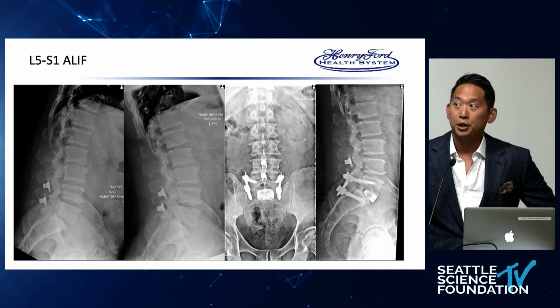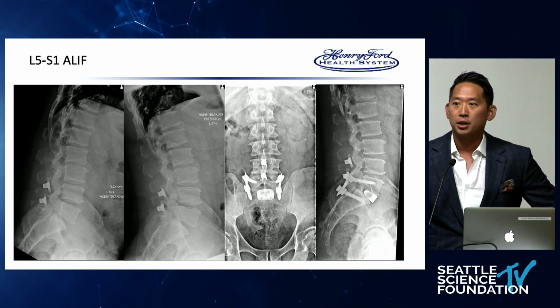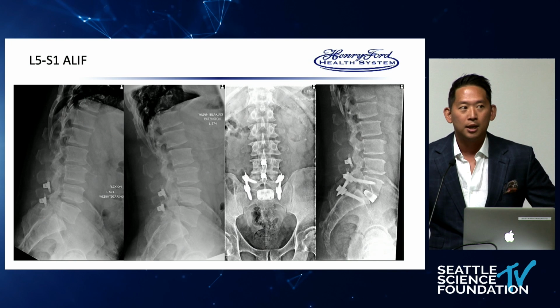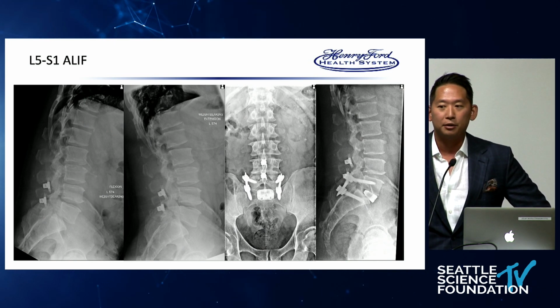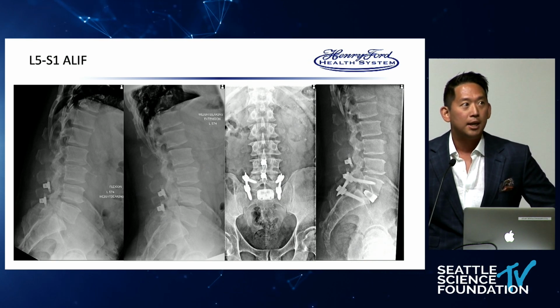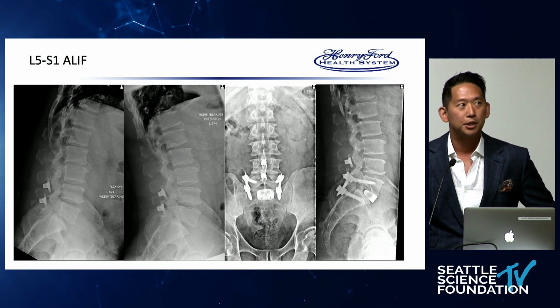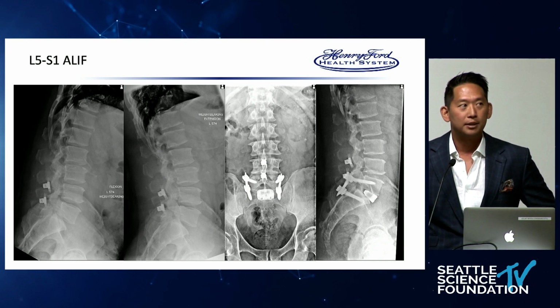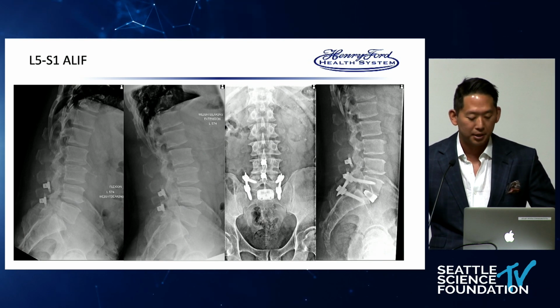So, here's another real world example. This was a younger gentleman. I think he was a tradesman of some sort. He had developed back pain and saw another surgeon in the area who decided to put 2 interspinous devices. I'm not sure if it projects well, but this patient actually has a pars defect at L5, and he's got a slight isthmic spondylolisthesis that's mobile. I don't have the CT, but you can see it pretty clearly. So I think the diagnosis here was missed. The patient had back pain, but also had that classic L5 radicular symptoms that you get with people with the L5 isthmic spondy.